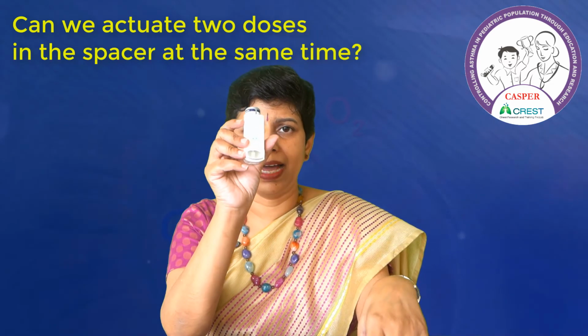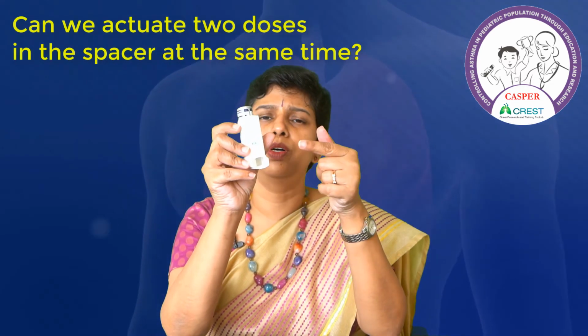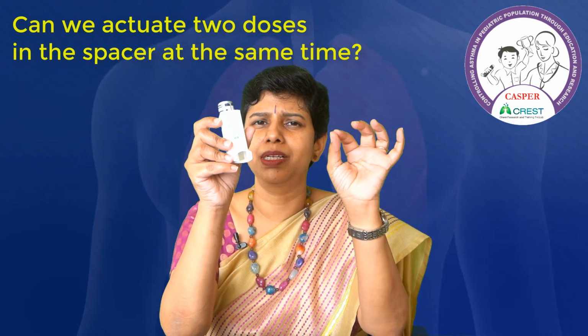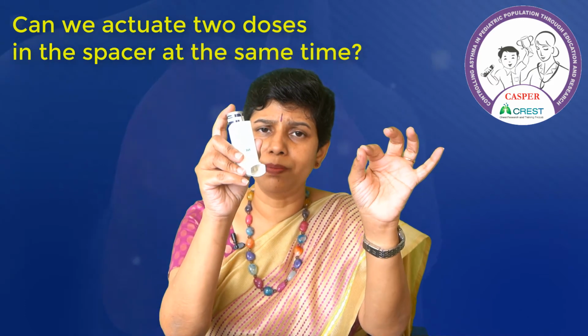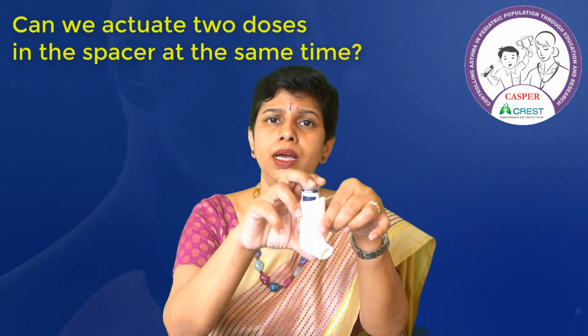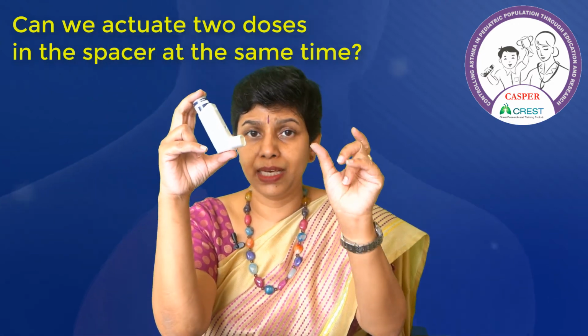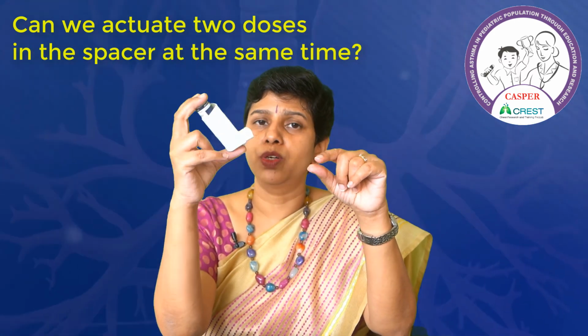Secondly, when the drug comes out of the valve, it also comes down to a very cold temperature. It's about minus 30 degrees C. So we should allow it to come back to room temperature so that the next dose that is released is also equal in dosage.